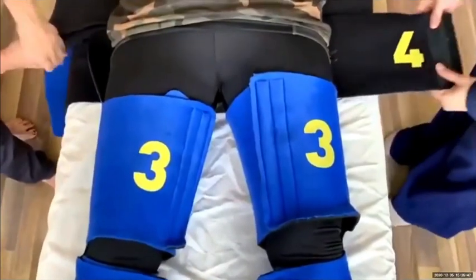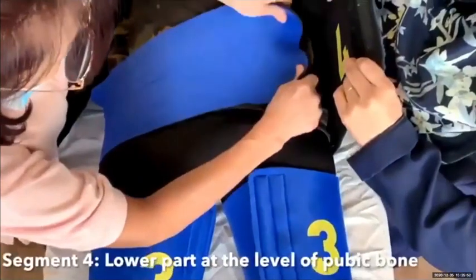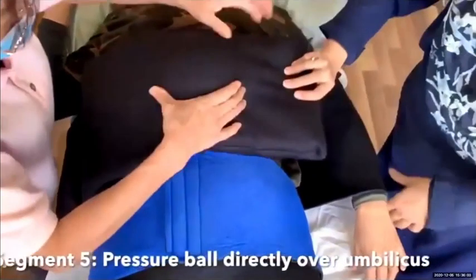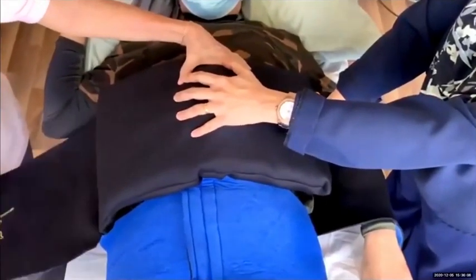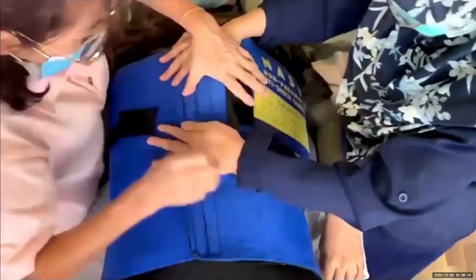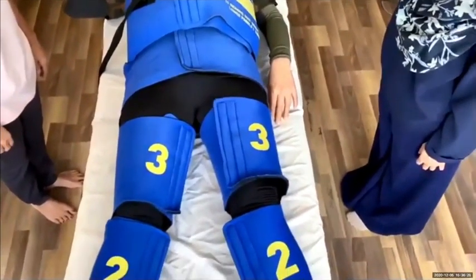Segment four goes around the woman with its lower part at the level of her pubic bone. Segment five is the pressure ball — it should go directly over her umbilicus, and thereafter close segment six over the pressure ball.